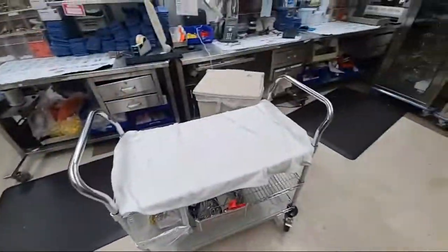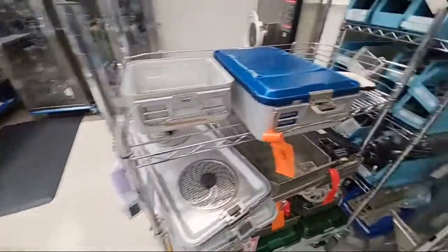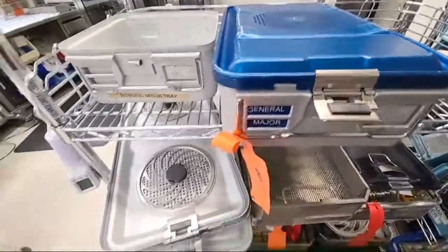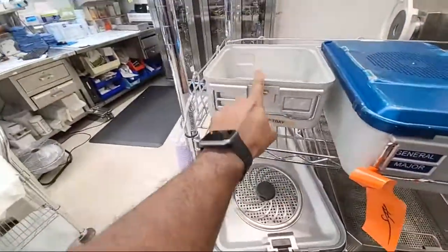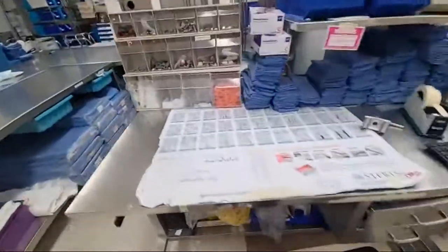So after we put them together, if they go in a rigid container, we put them in this. This is a major tray. This is a robotic minor tray. So these robotics go downstairs to our CVOR. We put them together. We lock them up.